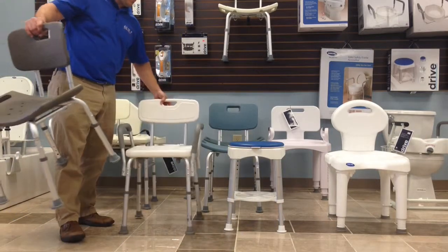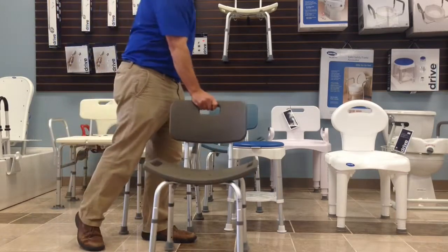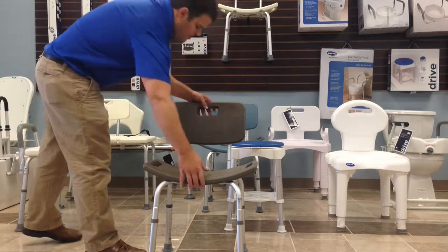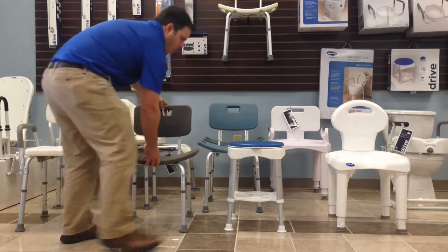The next is a shower chair without arms. It's got a little bit wider seat. It also comes in a variety of different colors so you have a few options. All of these shower chairs and seats are height adjustable.